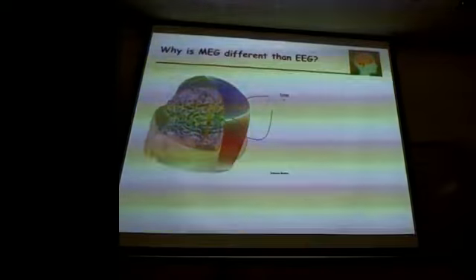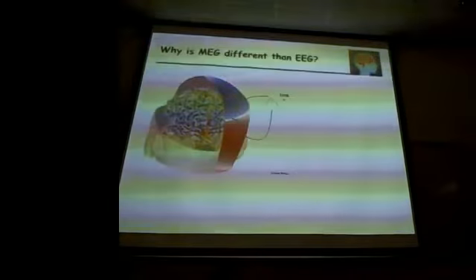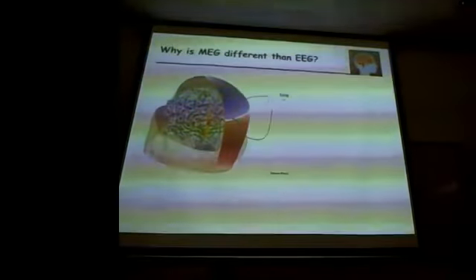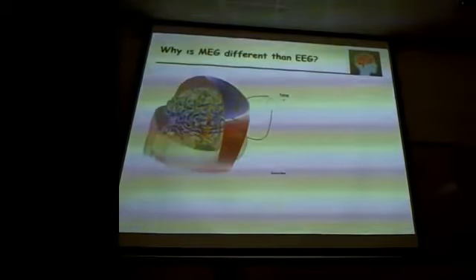They're really measuring the same underlying activity. They also both have the same temporal resolution, which is on the order of milliseconds. We could collect data faster, but the brain really doesn't go any faster. If you collect data at a faster rate than 1 millisecond, you're just filling up your hard drive. It's just extra information. So that's where both MEG and EEG have topped out, collecting data at about 1,000 hertz, and that's pretty much where people stop.